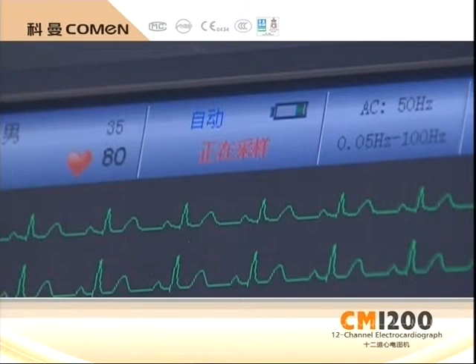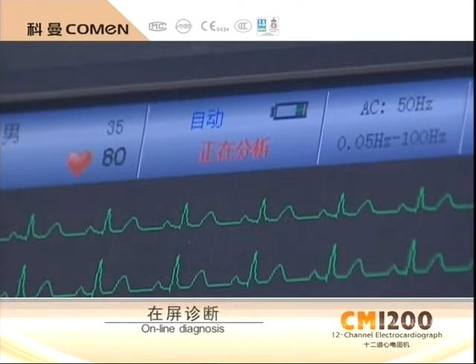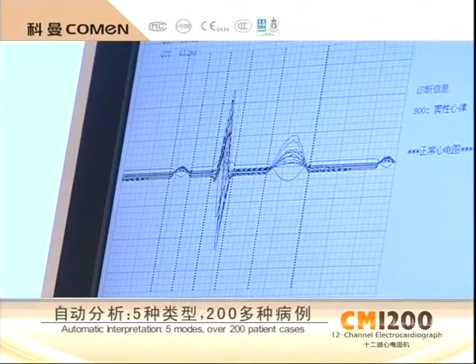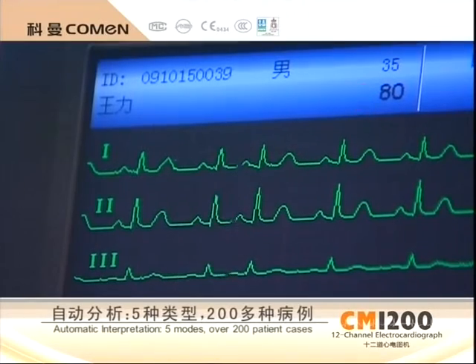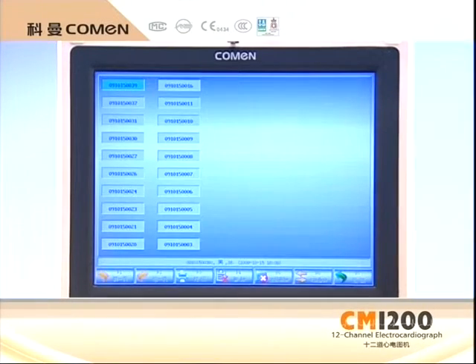The advanced automatic analytical and diagnostic function can perform analysis on 200 kinds of cases in five categories, providing a more professional diagnostic result.